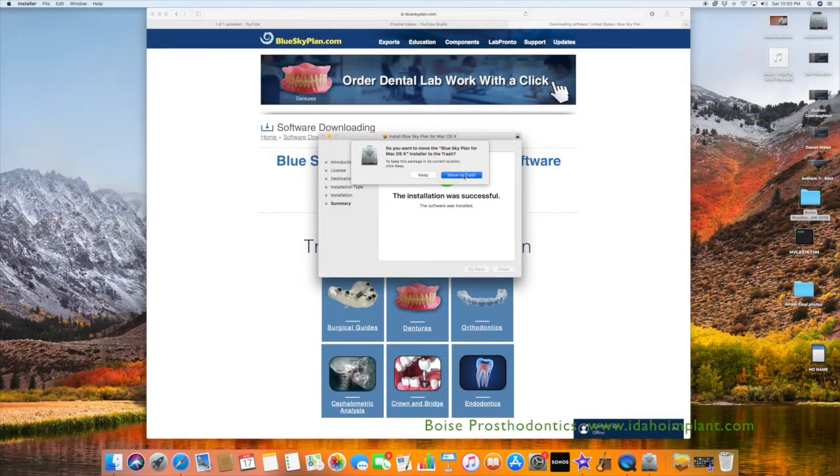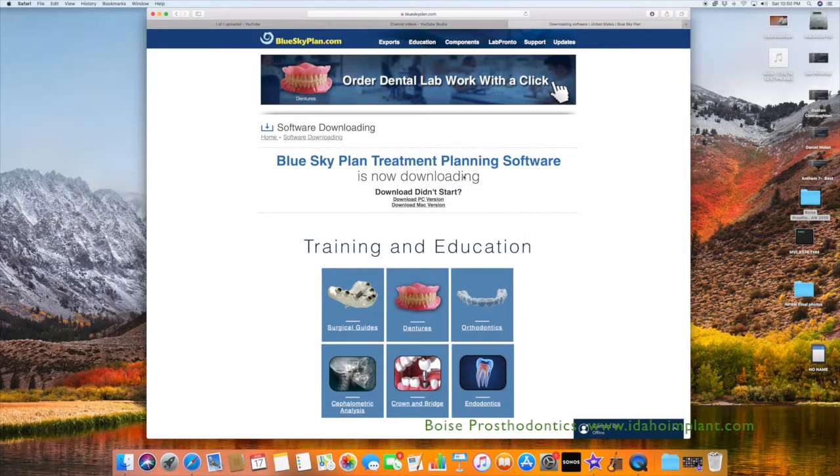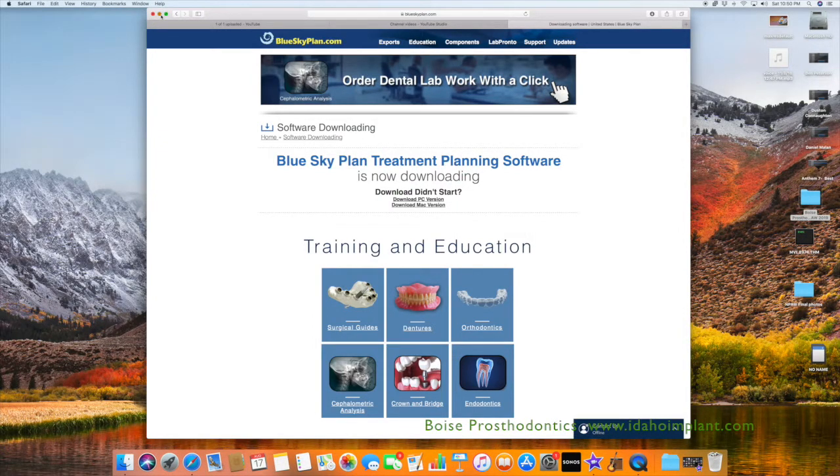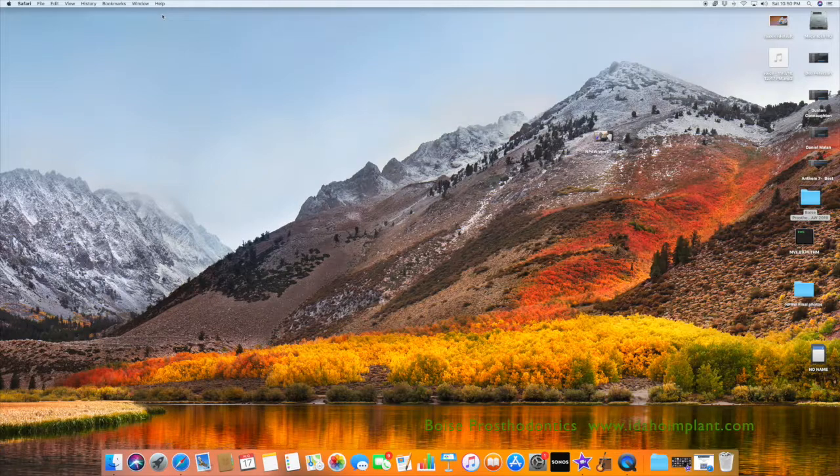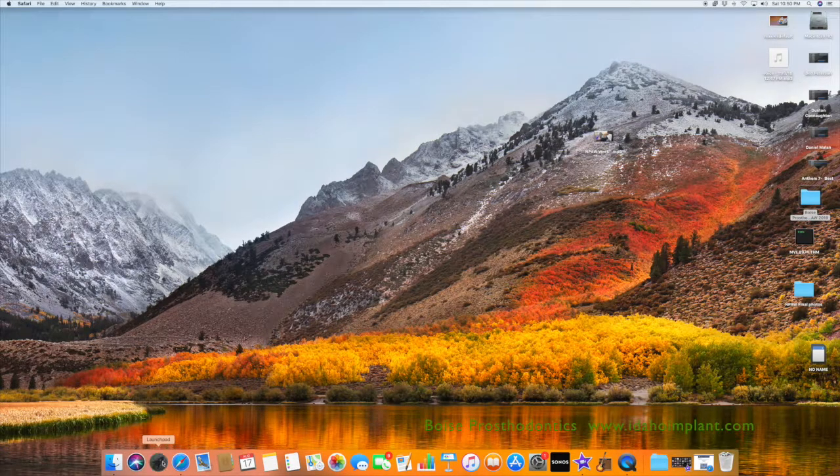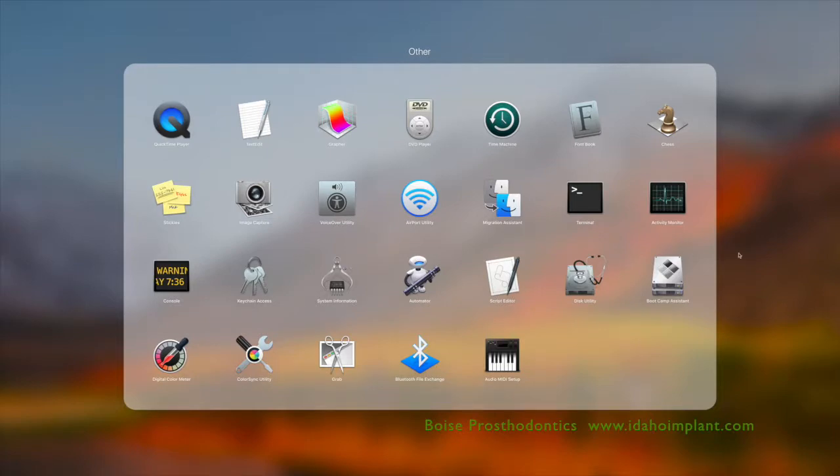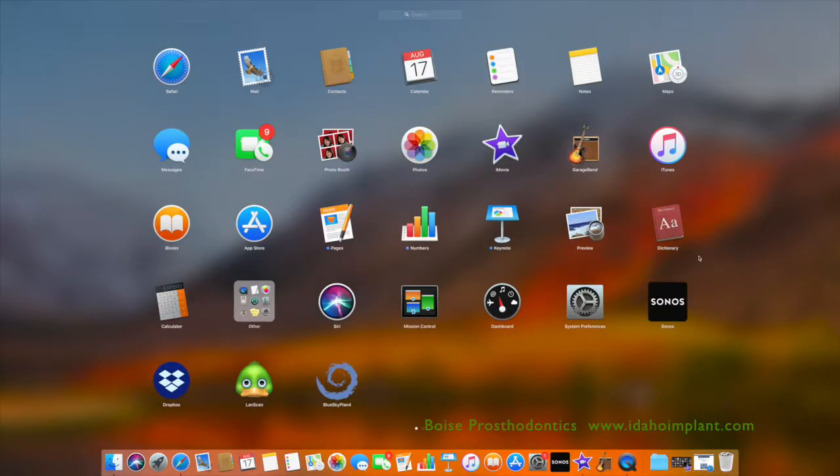But first, you need to go find the software which is in your Launchpad down on the bottom left of the screen. You'll then find the software. There it is, BlueSkyBio. Double click it.